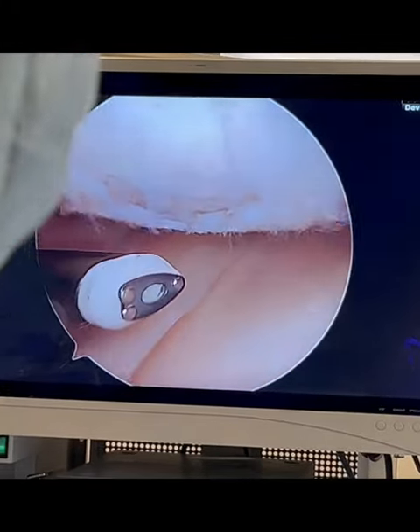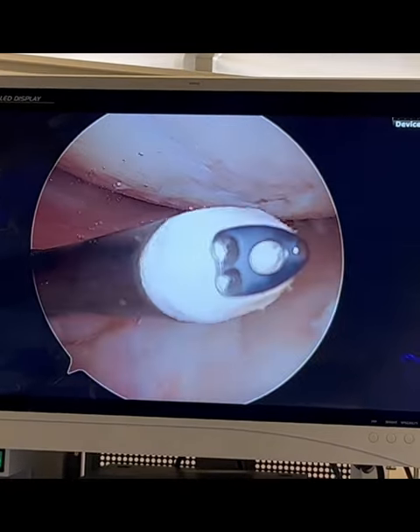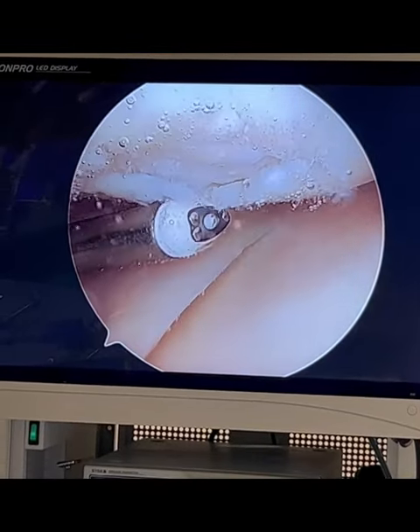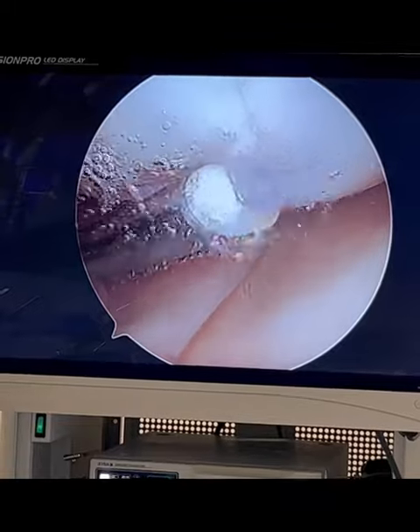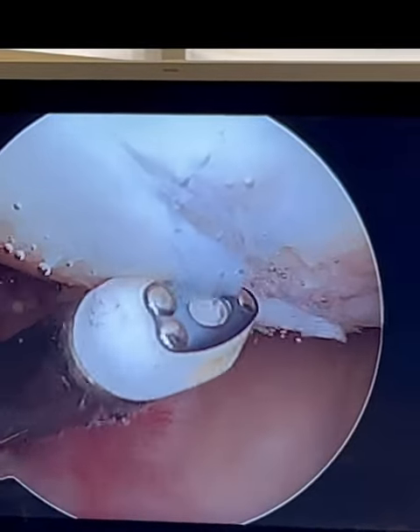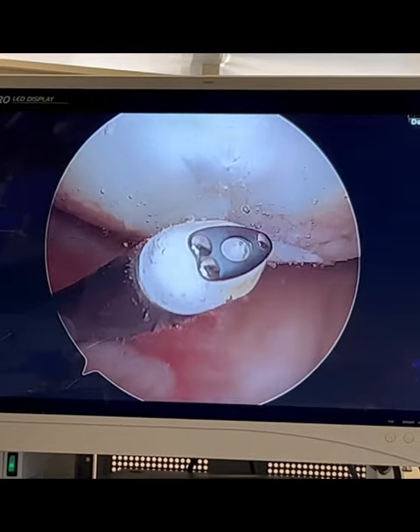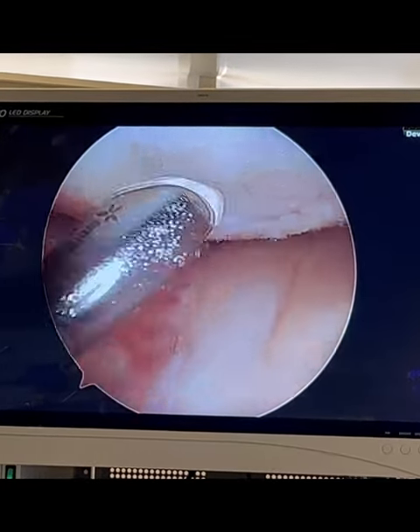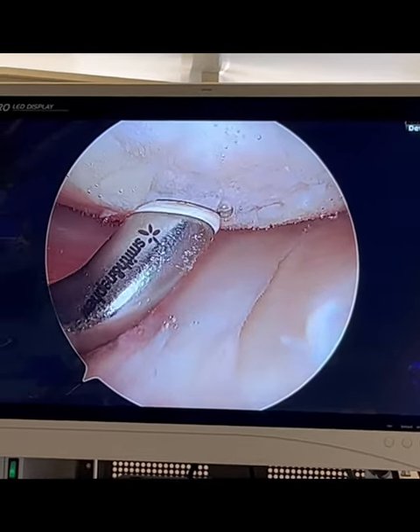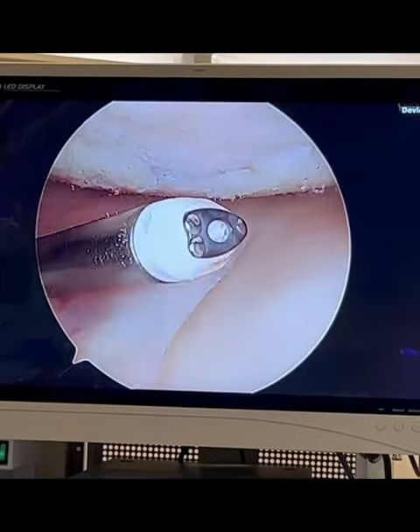I'm going to do a very simple procedure here using this device that looks like a tiny little iron. It's used to remove the loose pieces of articular cartilage — that's called chondroplasty. So you may have seen that on your operative reports. And that is exactly what I'm doing right now: removing these tiny fragments of articular cartilage that have peeled off the surface, just like old paint that peels off a window frame.